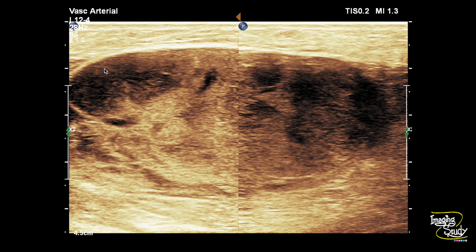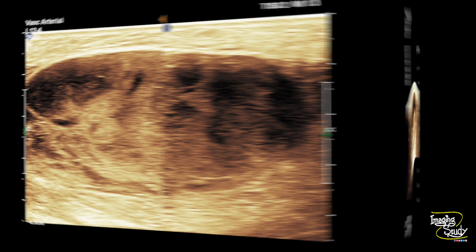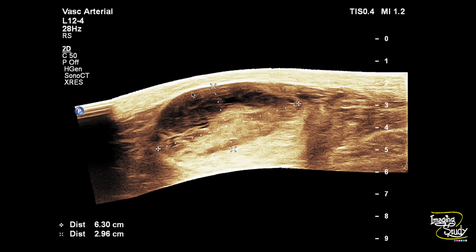Here is another picture of the hematoma containing blood products of variable ages. Here is a panoramic view showing the hematoma within the gastrocnemius muscle. The lesion is around six by three centimeters.